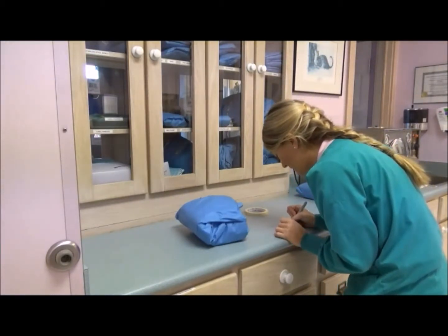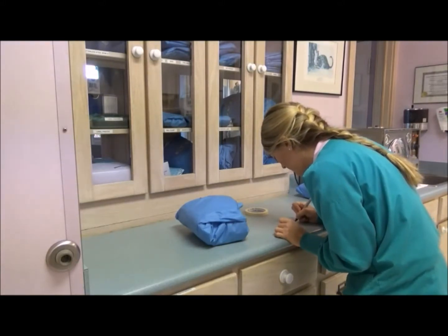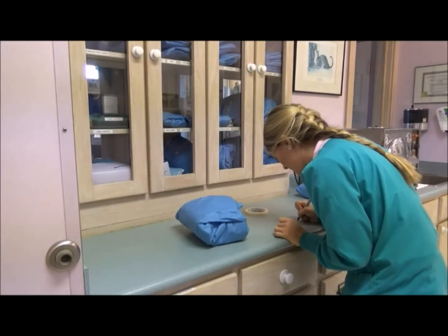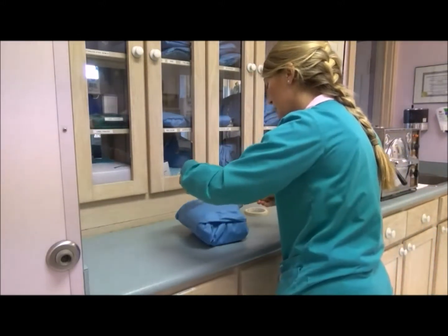I'm going to write a description of what's in the pack, which is a surgery gown. I'll put today's date and my initials, and I'll put it right on the center of the pack.